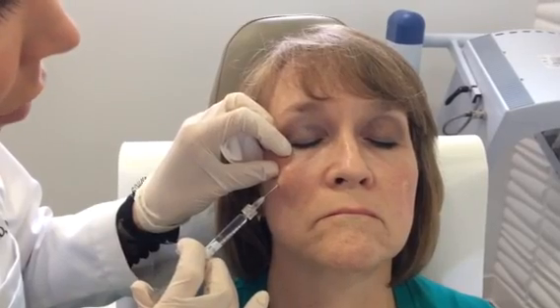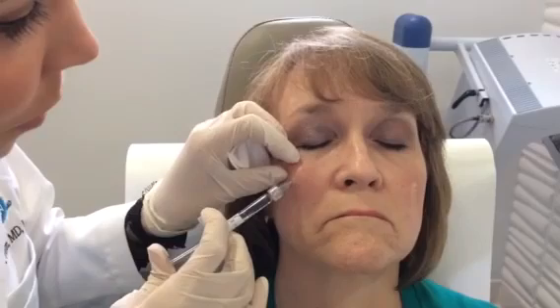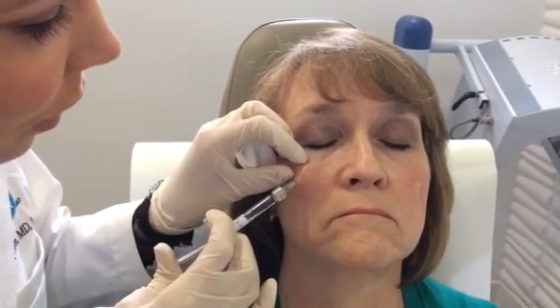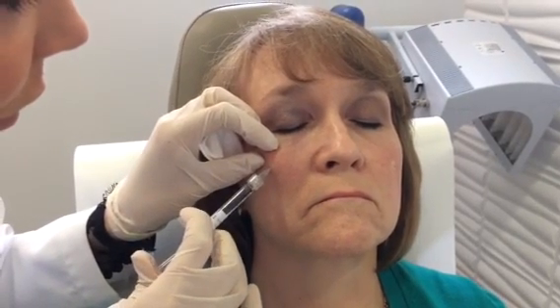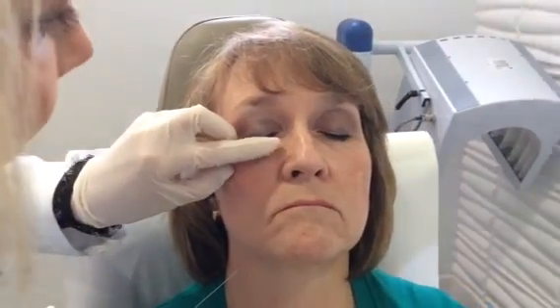I have a strong preference for Restylane in this area. It's a hyaluronic acid filler, but it's a gel particle one, and it doesn't collect as much liquid or water after you've filled it. For that reason, I really do prefer it for under eye filling. If you use some of the other products, they can collect a little bit more water, and patients can sometimes have problems with swelling in the area after you've completed the under eye area.